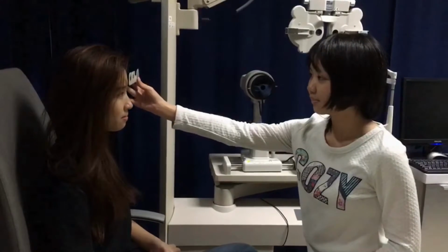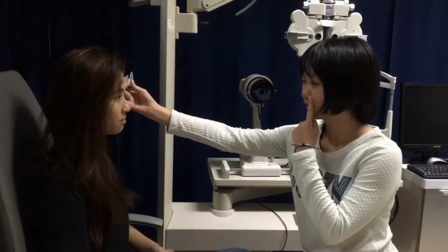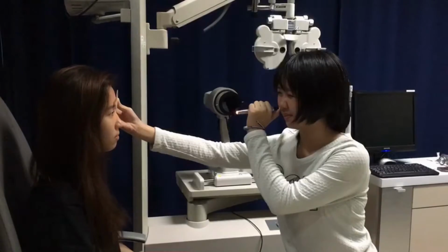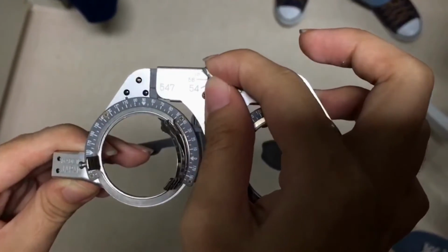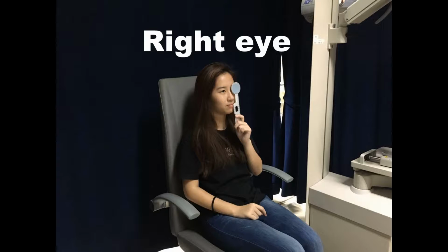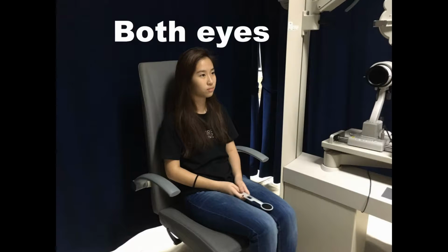Before conducting retinoscopy, take the pupillary distance of the patient using the limbus to limbus or corneal reflex method. Adjust the trial frame or phoropter to fit the patient's PD. In this demonstration, we'll be using the trial frame. To get a rough idea of where to start, do the unaided visual acuity test, first with the right eye, then with the left eye, and finally with both eyes.